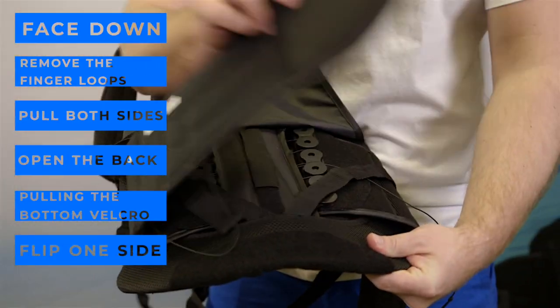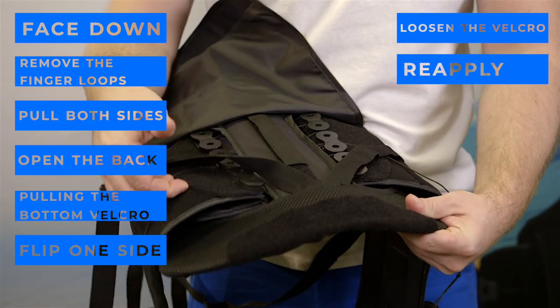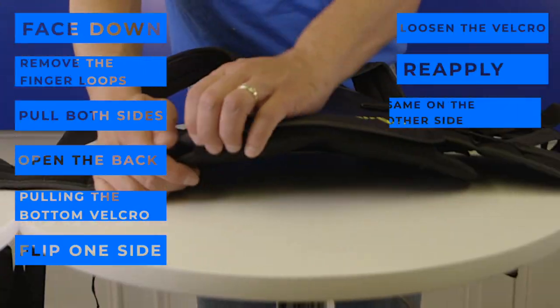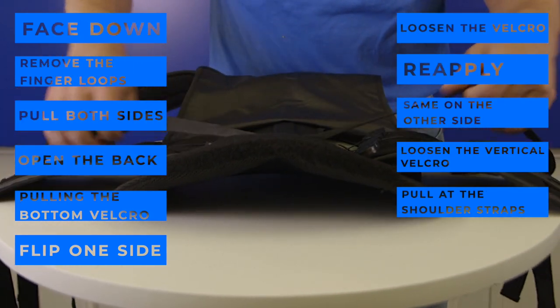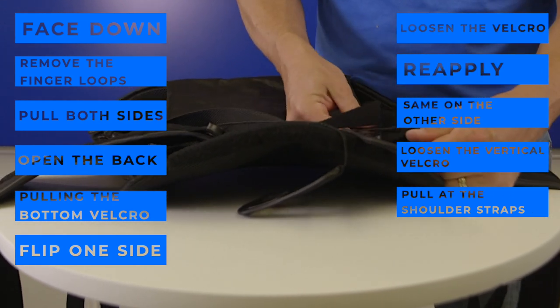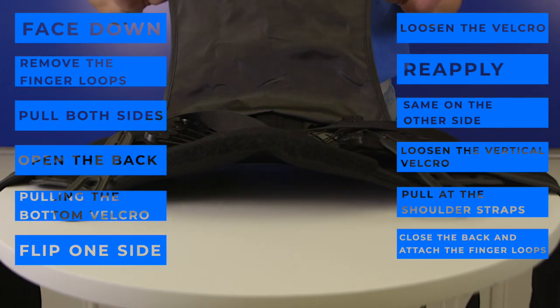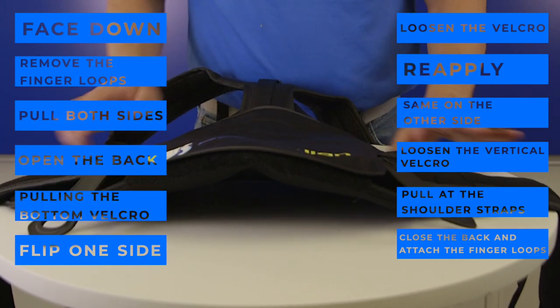Flip one side of the belt over, showing you the size guide. Loosen the velcro and then reapply back to your waist size. Do the same for the other side. Loosen the vertical velcro and pull the shoulder straps up to where the top of the brace is approximately six inches above the back panel. Close the back of the brace. Attach the finger loops to the brace so that you can easily grab them when putting on.